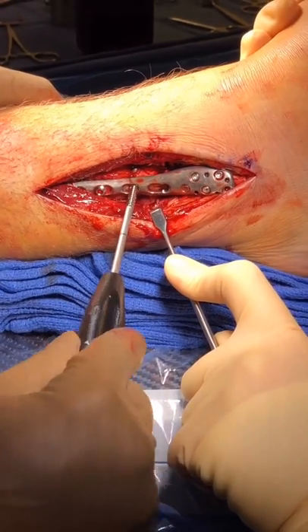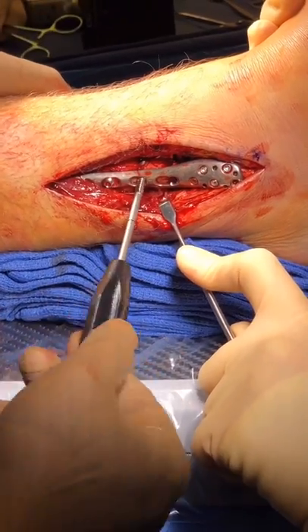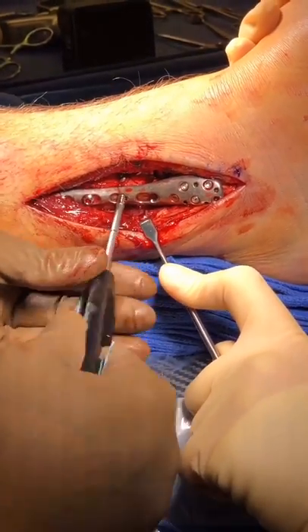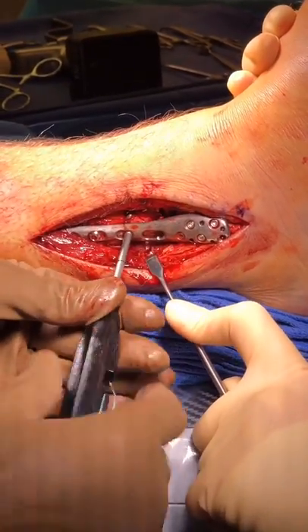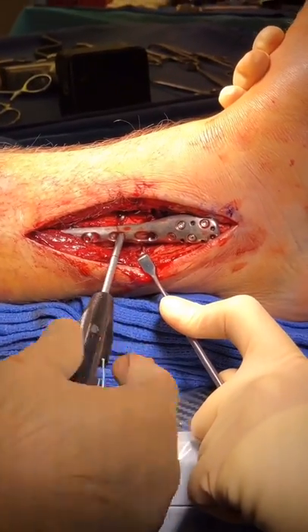Out, we'll go ahead and slide in our tibial screw and advance it, and it should come to a hard stop in the tibia, and there'll be an increased torque to indicate this, but it's also useful to check on fluoroscopy to confirm.